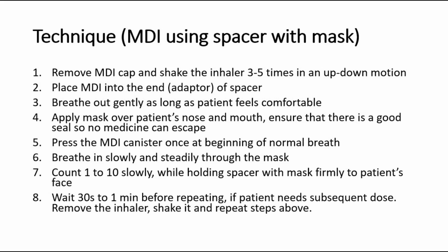Place the MDI into the end of the spacer. Breathe out gently as long as the patient feels comfortable. Then apply the mask over the patient's nose and mouth. Make sure that there is a good seal so no medicine will escape.